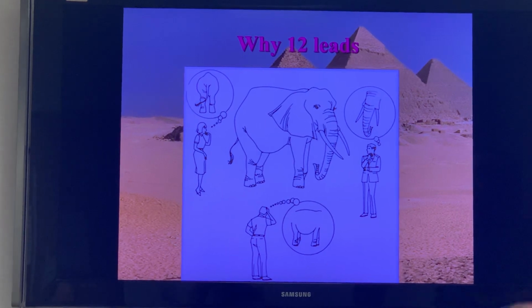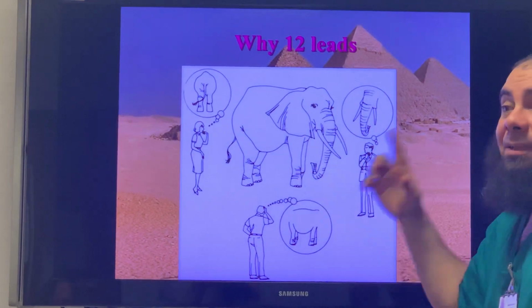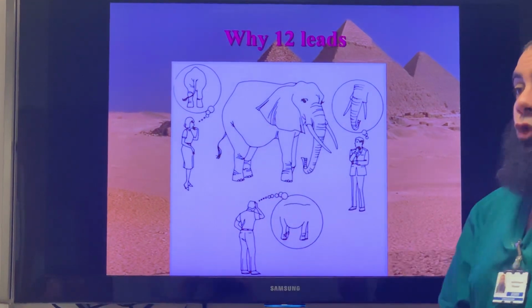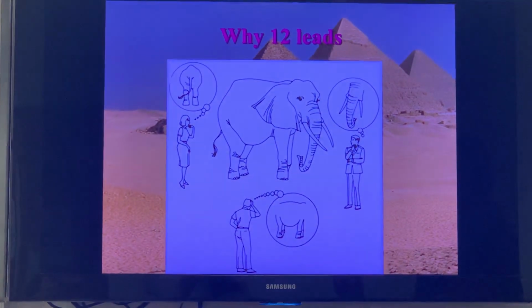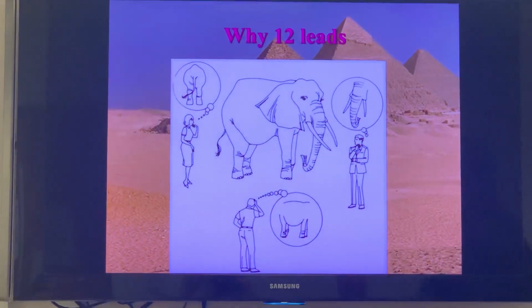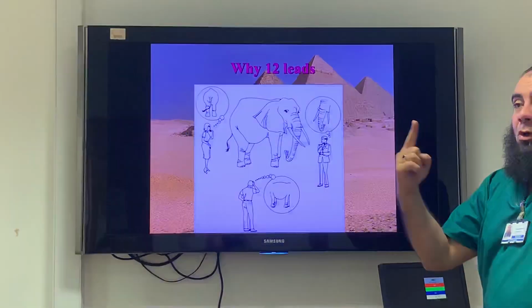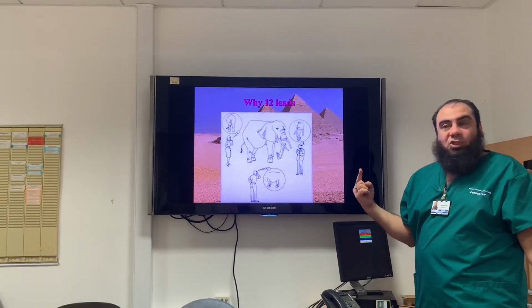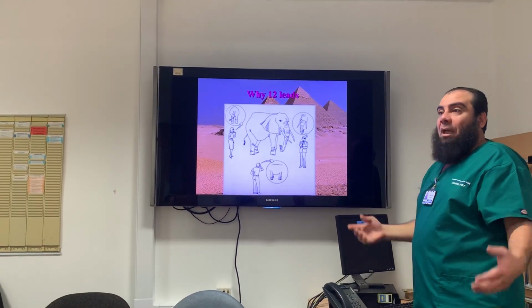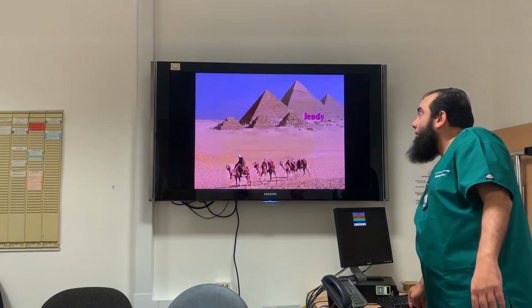Impossible. How can we get it? By getting photos from all aspects, even from the bottom to picture his abdomen, and sometimes from the top if we need. So it is moving around the whole heart to get every possible view, to interpret or to get some clues.